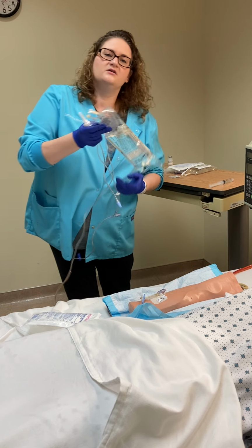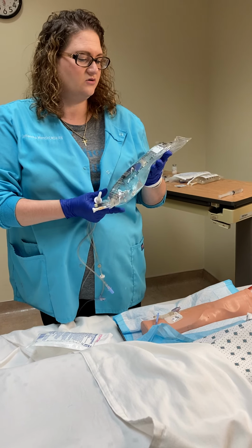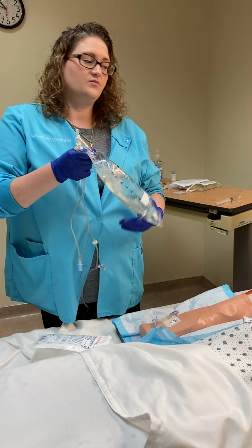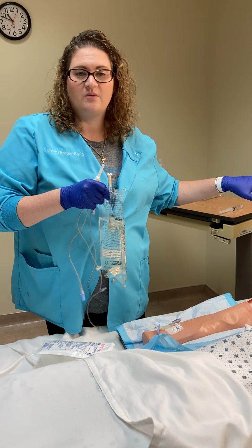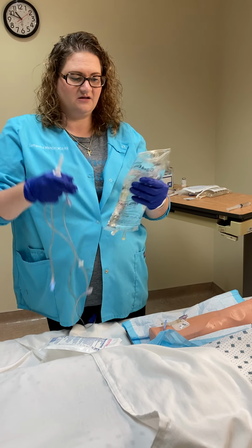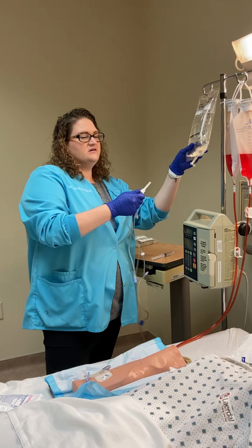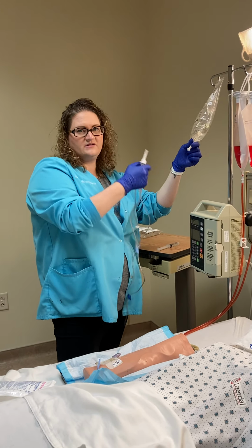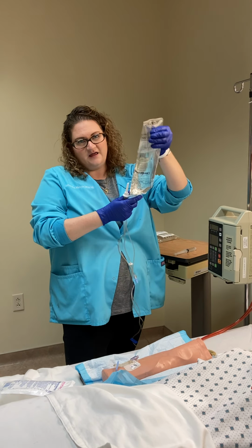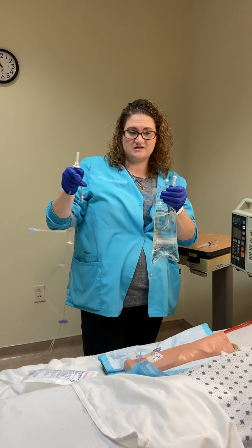We have our order, which is for normal saline. Let's say this is 1 liter, and we're going to do it over 10 hours. So when we program our pump, we're going to do 100 mLs per hour. Now most bags in the clinical setting, actually all of them that are not used, we can hang the bag like this and pull the stopper out and spike and it won't leak. When you're practicing in the lab, we have the golf tees, so you'll have to open the bag upside down, otherwise it's just going to leak.